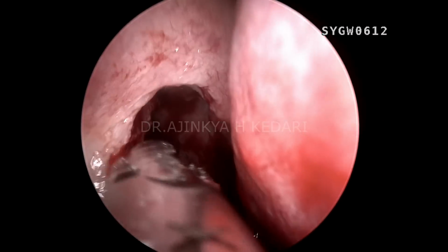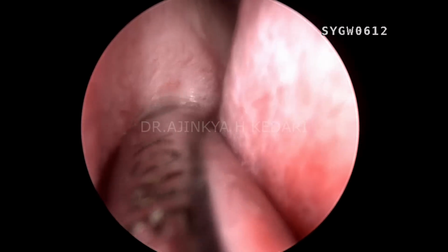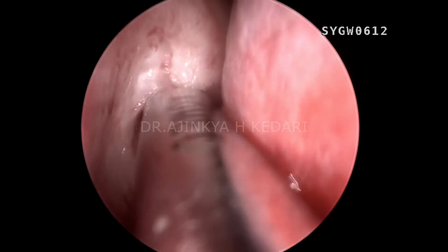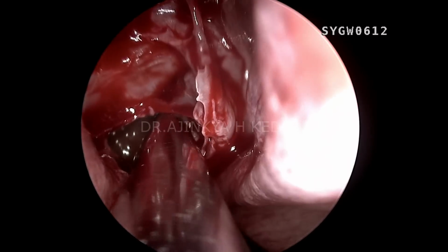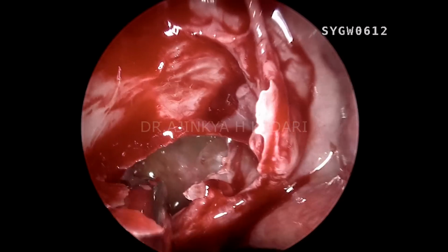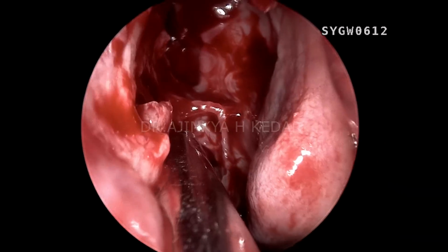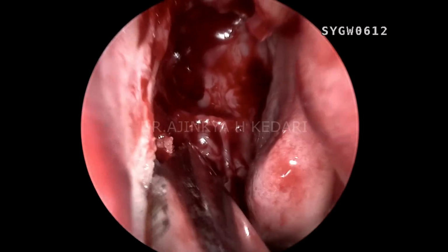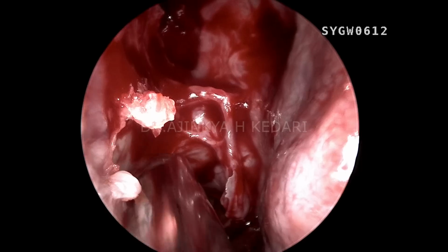So you can see the glimpse of the lowermost part of the frontal sinus area and the recess area as well. What I'm doing right now is, again, I'm going to go with the debrider and debride the axillary area as much as I can. With the debrider, you can see I am in the patient's maxillary sinus, trying to take away all that soft tissue so that I can have the maximum opening to the maxillary sinus and expose the floor of the orbit. So far, I've almost taken away the vertical process of the uncinate.